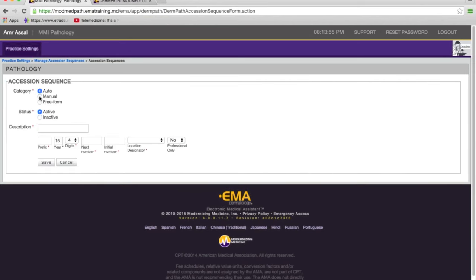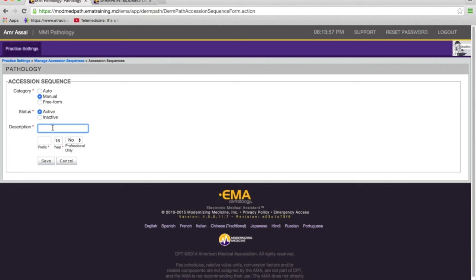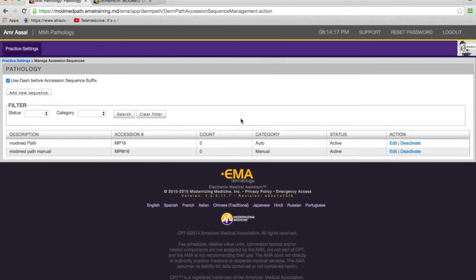I'll also quickly create a manual sequence to show you how it's used later. In case of manual, I'll give it a description and the prefix in this case is MPM. The number is then completely managed outside the module. Having done the setup here, I'm going to move on to the actual module.